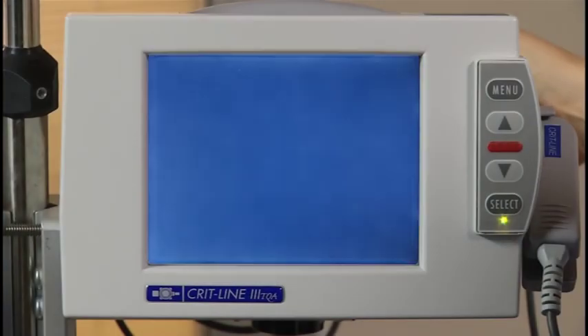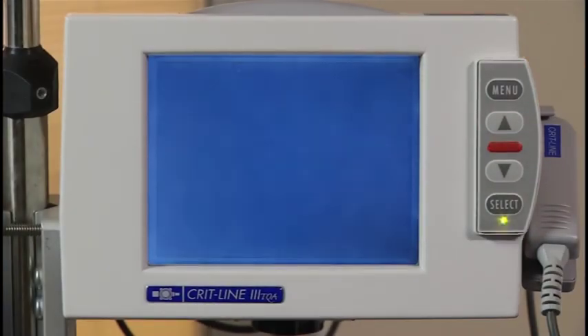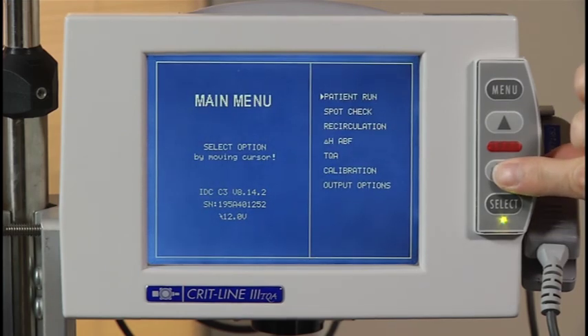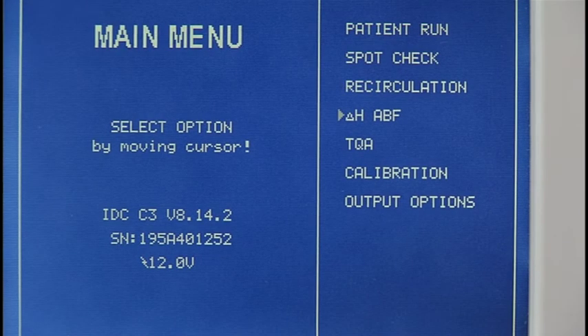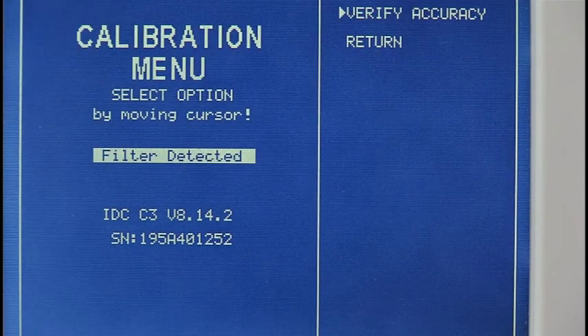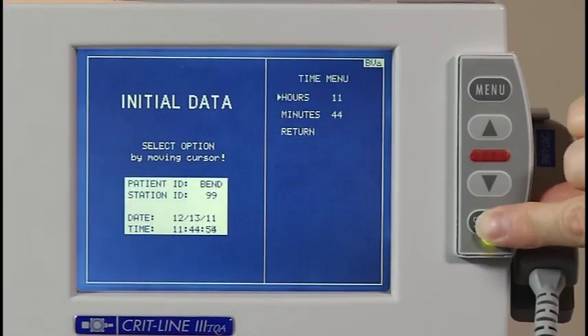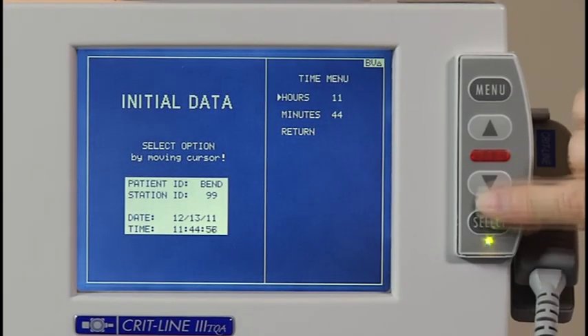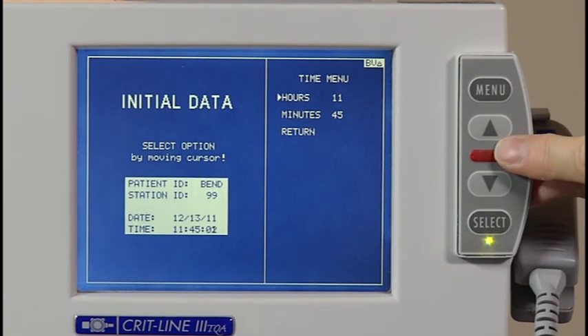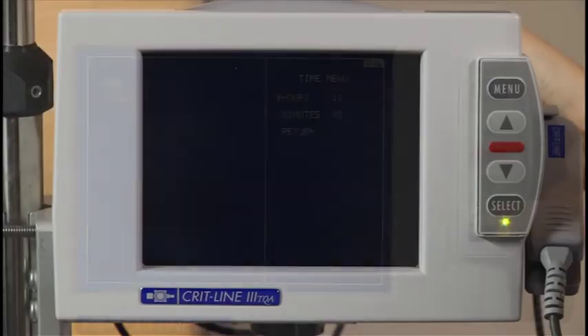When you turn the CRITLINE monitor on, you will see the main menu unless there is still data in the memory. From the main menu, you will scroll to either patient run to begin a patient treatment, or calibration to verify the accuracy of the CRITLINE monitor. The CRITLINE monitor is a menu-driven system. To move the cursor, simply press either the up arrow or the down arrow. When the cursor is at the option you want to choose, press the select button.